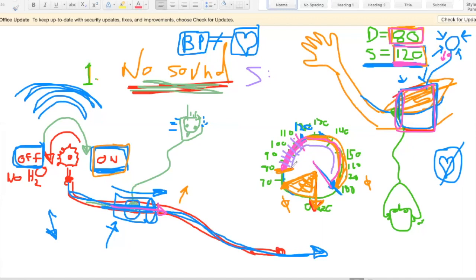And now you get to the point where the diastolic blood pressure, the pressure in the heart when the heart is relaxing, is still going to be always higher than the pressure in the sphygmomanometer. And then you won't hear anything anymore because it's white noise. So you're going to pump all the way up past the systolic blood pressure. You won't hear anything. Reduce the air in the cuff by about 2 to 3 millimeters of mercury per second.